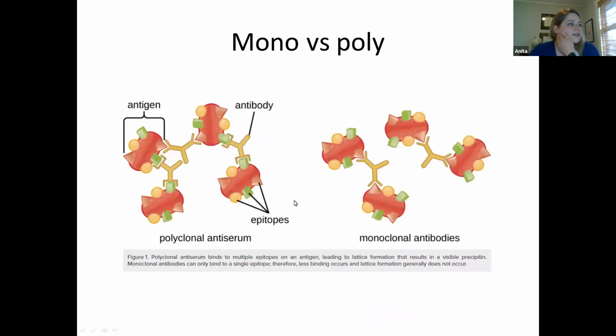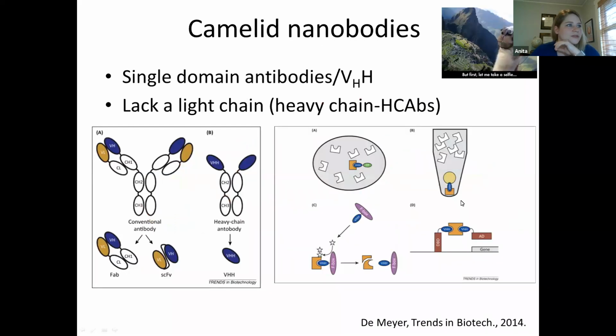So again, with the polyclonal antibodies, they're going to be recognizing different epitopes, but with monoclonal, they're going to be against the same epitope. So you're going to have maybe a lower background, a cleaner staining. You might have lower signal. And if you're using a mouse antibody on mouse tissue, sometimes you can run into problems doing that.